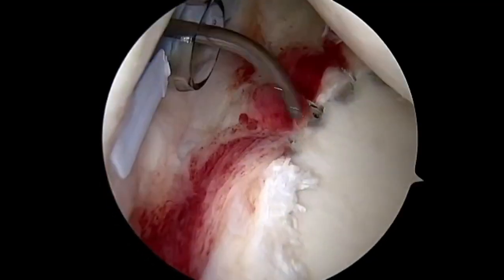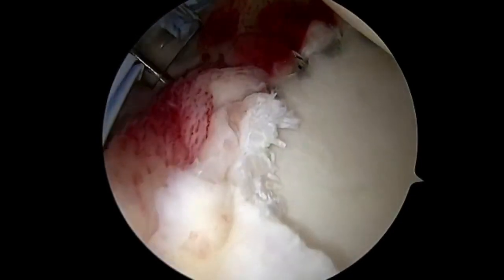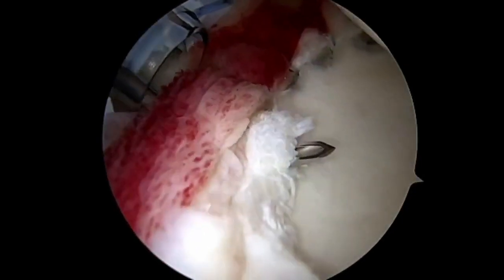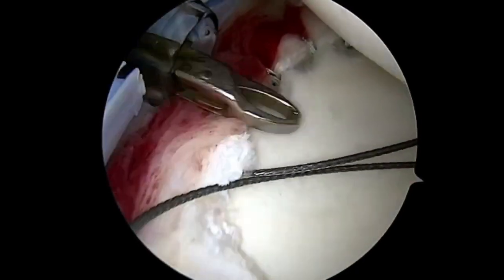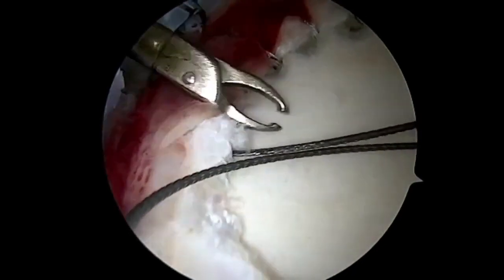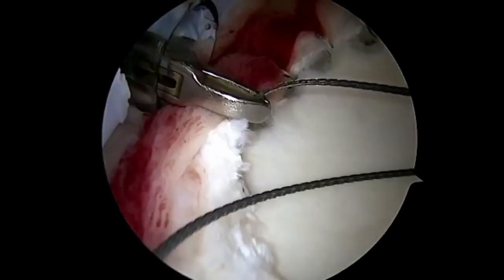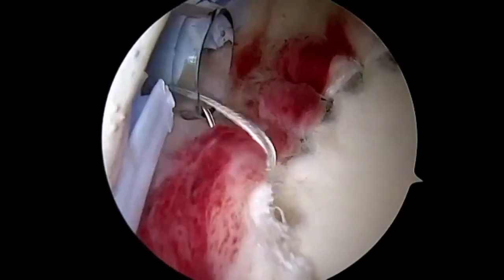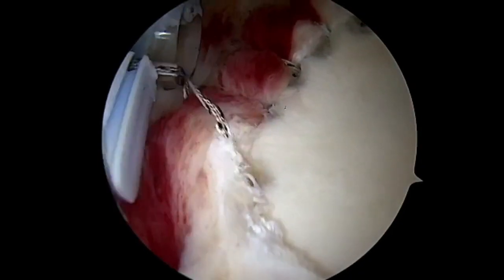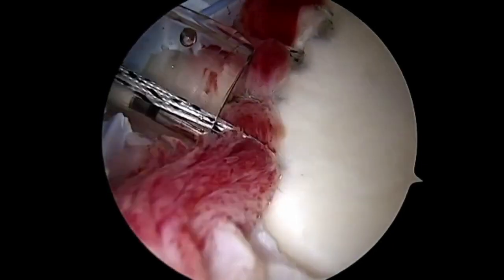As we get to the superiormost anchor, sometimes we'll switch to a 90-degree passer, which gives us a little better trajectory. Again, we'll shuttle in as much wire as we can and pull out the instrument. The assistant holds the free end of the wire that's out of the joint. We'll reach in with this loop grasper, grab the wire, and pull the loop end out so that it can be loaded with suture. Again, this does not result in tangling of the suture when done appropriately.